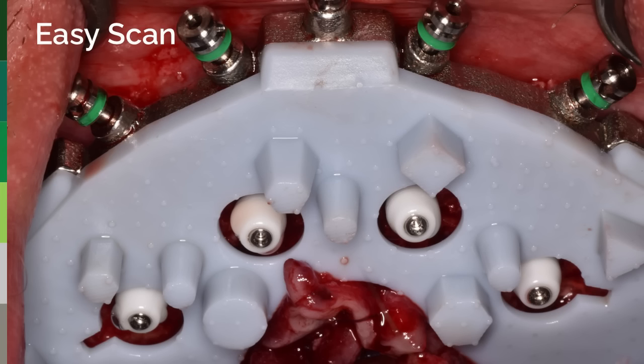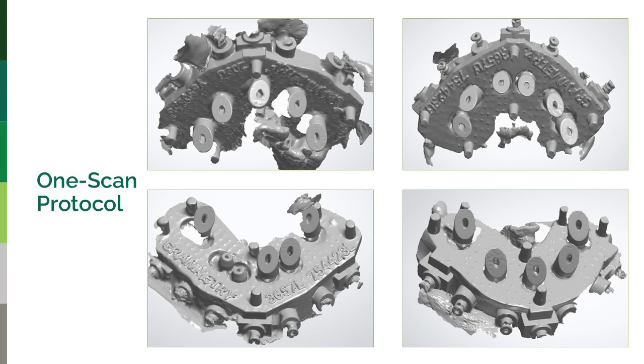And this is a simple scan, a very easy, repeatable scan. These are scans captured by Dr. Fraunfelter, who helped us work through this whole process over the past summer. And you can see, if you recognize these shapes here, this is a Micron Mapper.